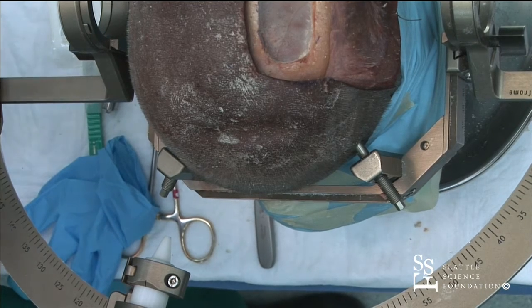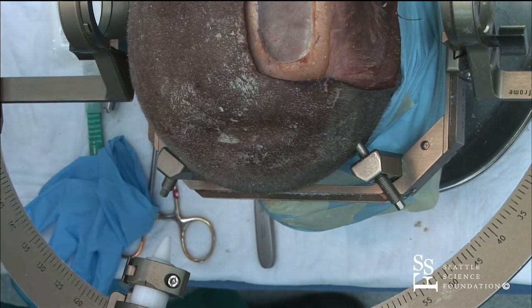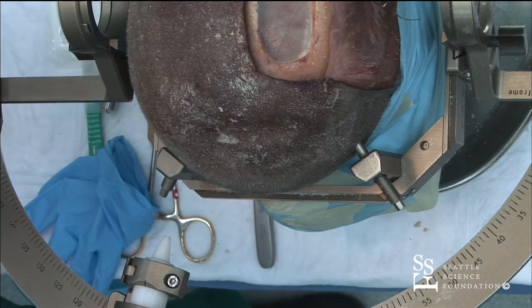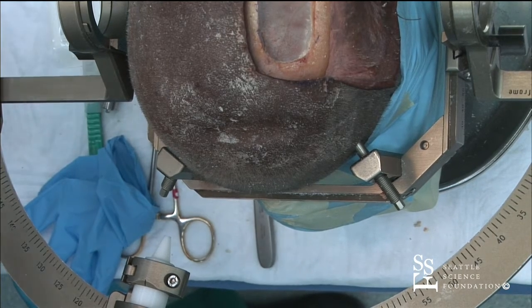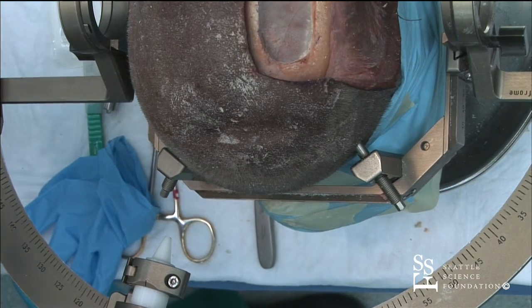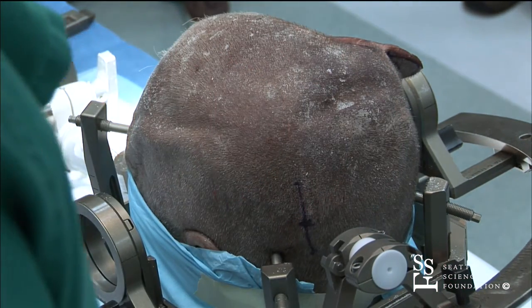You probably could use the NexFrame or ClearPoint or even a Vertek arm or Vario guide. I probably would not recommend using the Vario guide at this point, or the Vertek arm with the Medtronic frameless, because I'm not sure that the accuracy is as good. Basically, you want to get a 2 millimeter or less accuracy with whatever method you're going to use. And the frames are very tried and true, and I feel like they're the most reproducible for placing these depth electrodes. So here we plan the trajectory, and we've used the Leksell frame.